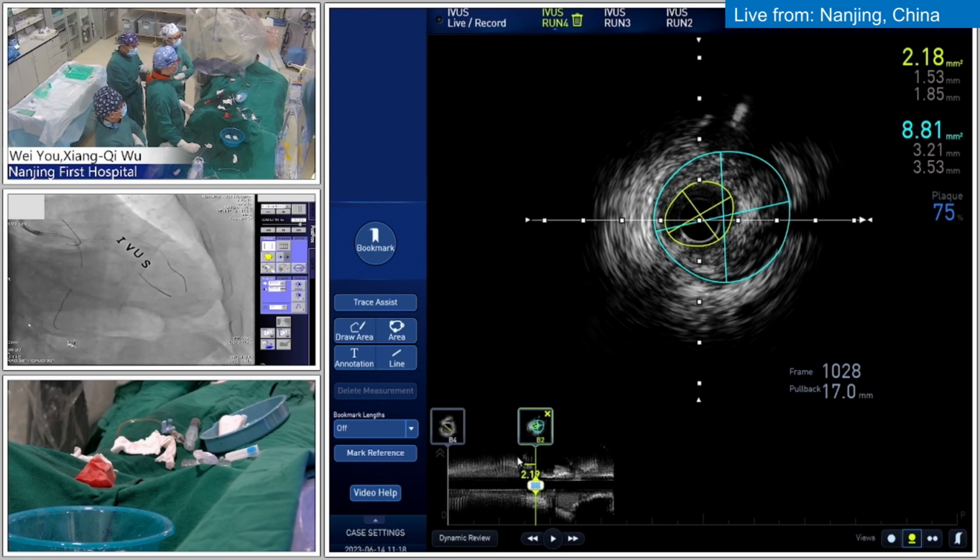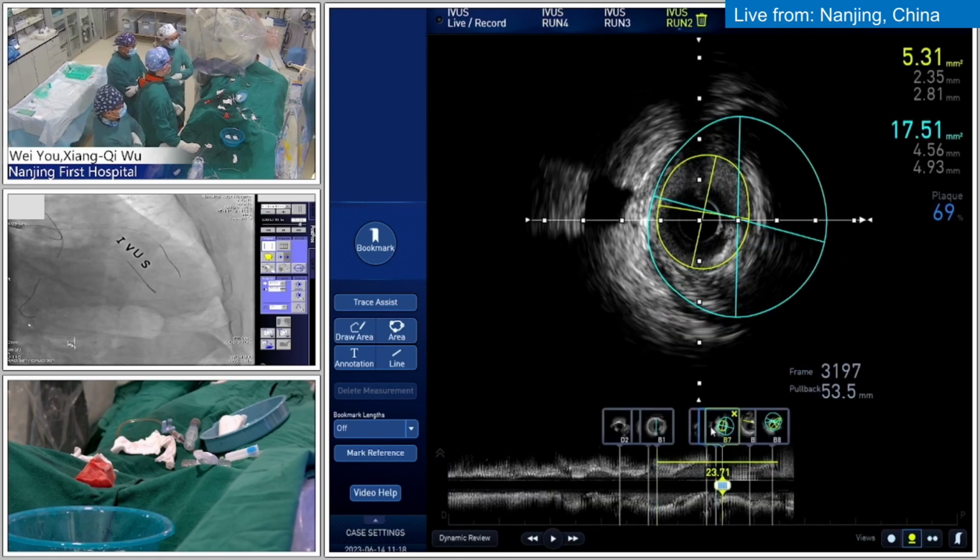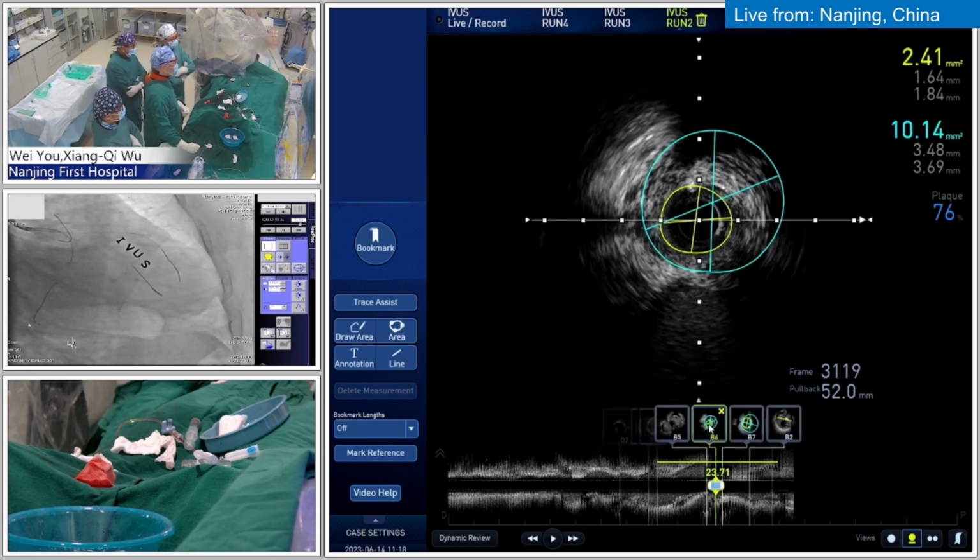All the questions I'm reading so far are talking about bifurcation strategies. Right. I think the key point for today's case is the bifurcation site. Just from the IVUS result, I insist on the provisional strategy. Even by IVUS measurement, we find the lesion length of the side branch is less than 10, not a complex bifurcation, just according to the definition criteria. And from the data from the EBC main, provisional stenting is also our priority choice.